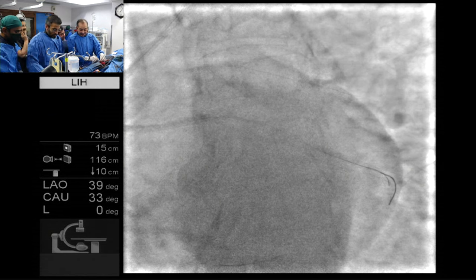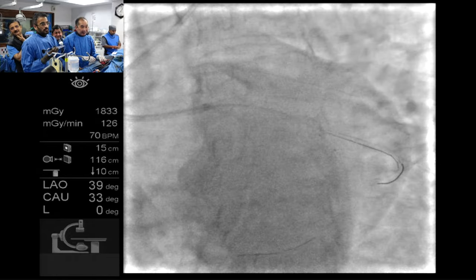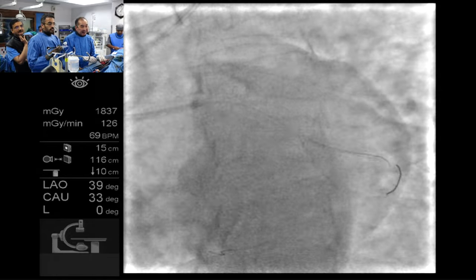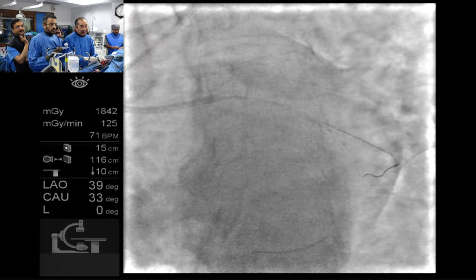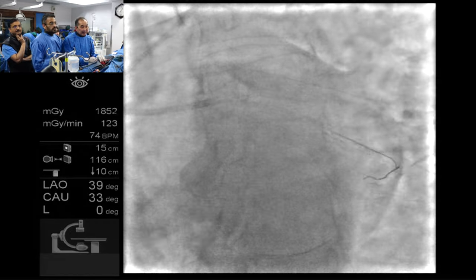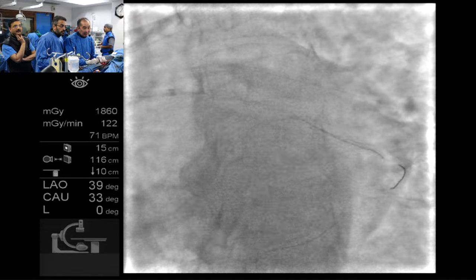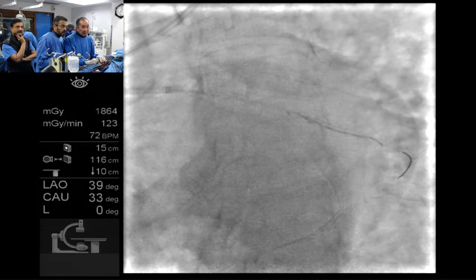Not too many. Not too much. Tak, you know, we're all rooting for you here. One of my earlier questions was about the utility of OCT, and maybe just trying to understand exactly what the problem is. It may be that you've really come under a lot of the crushed stent. Okay, we have crushed now.